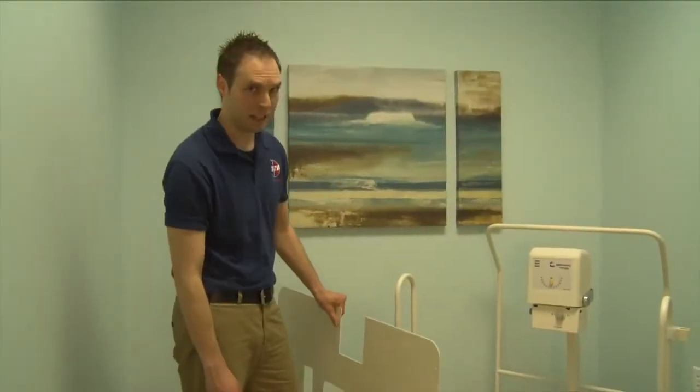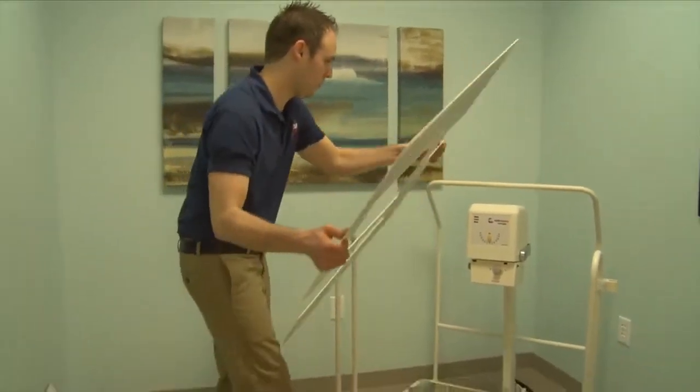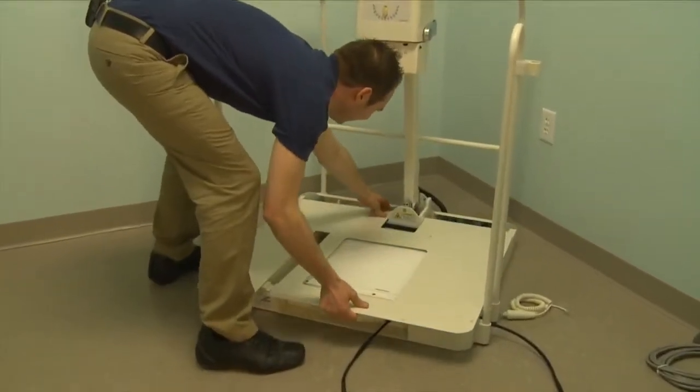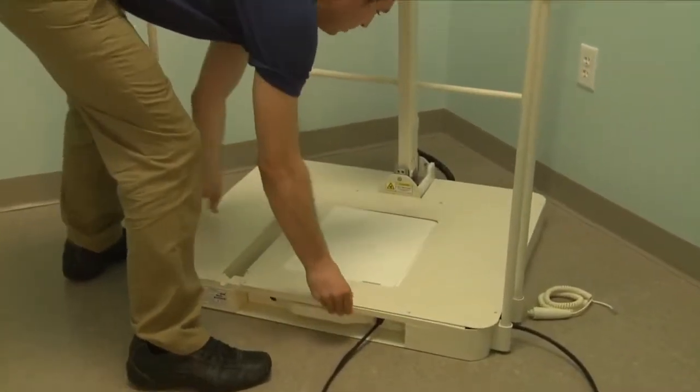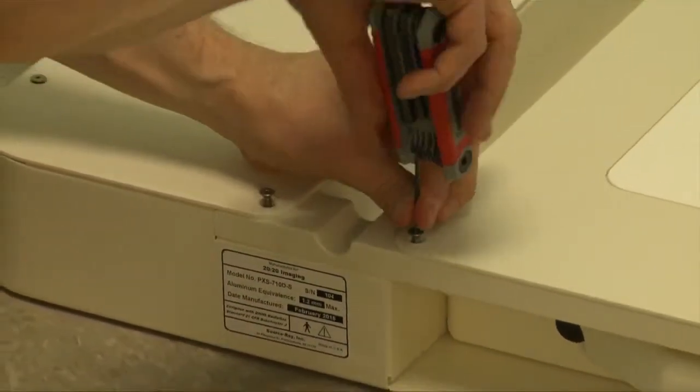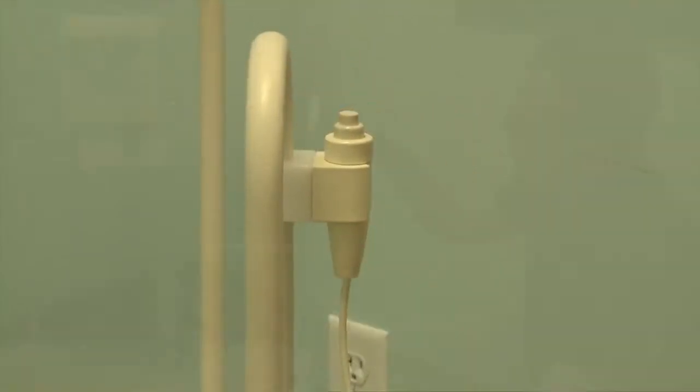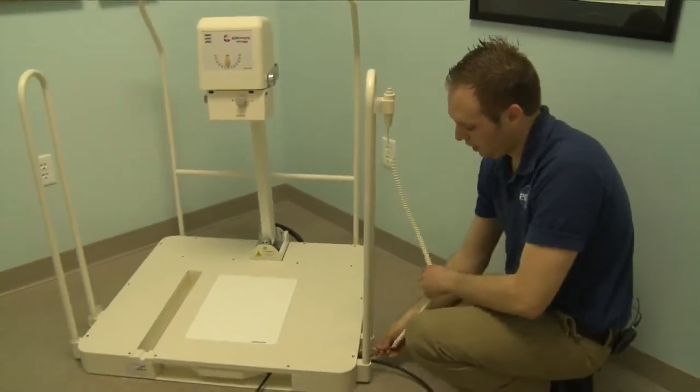It's now time to place the cover back on top of the base. Once the top of the base has been secured, the next step is to install the exposure switch. Place the exposure switch into the top holder and plug it in right at the bottom of the base.